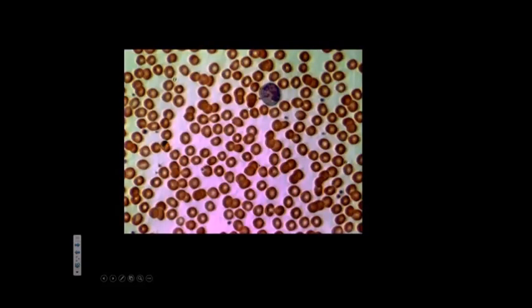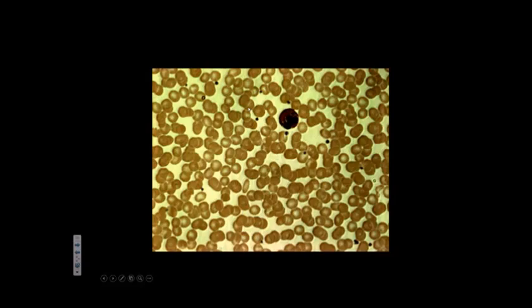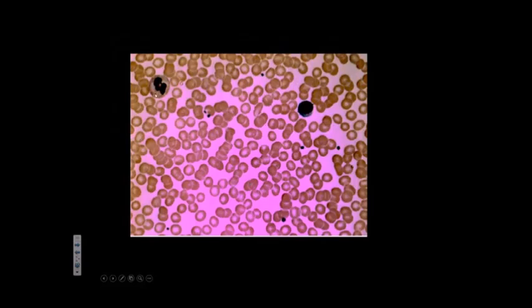Monocyte. Another monocyte. I would bounce between neutrophil or basophil and eosinophil. So what's your call? Anybody? Okay. So this one right here, small amount of nuclear material. Lymphocyte, this one is neutrophil. Basophil, I guess. Neutrophil. What's this one?